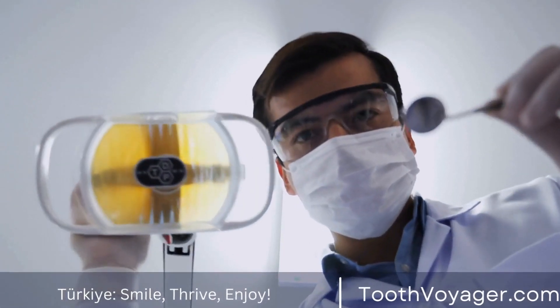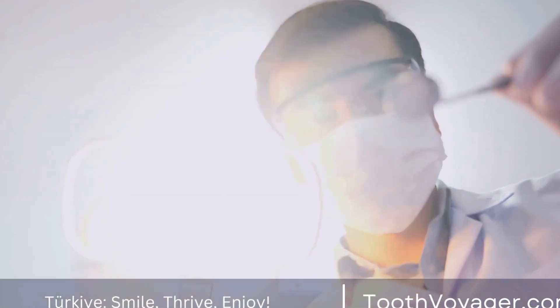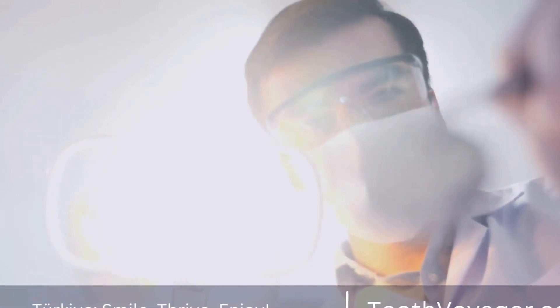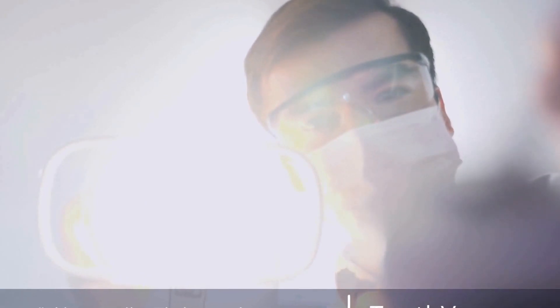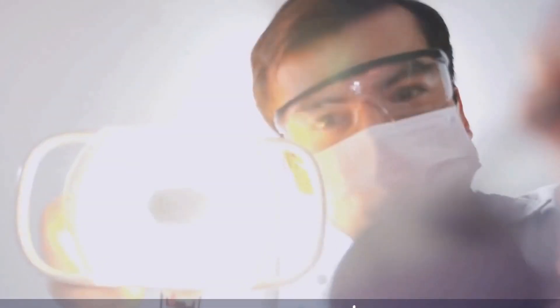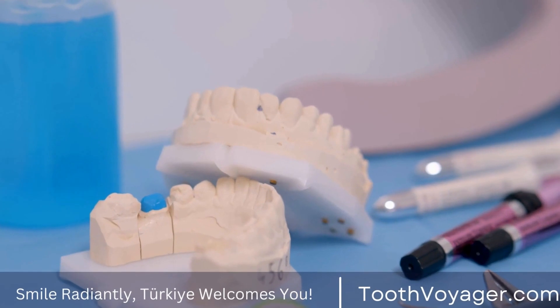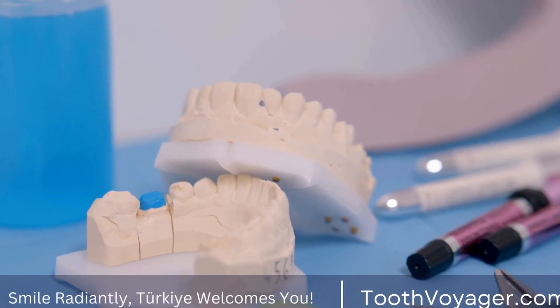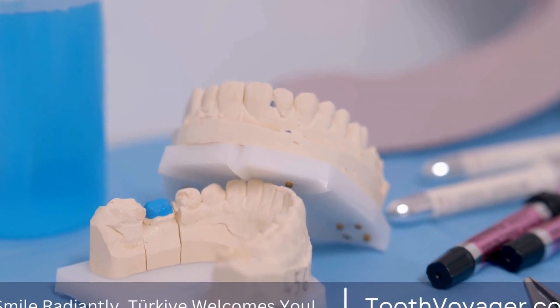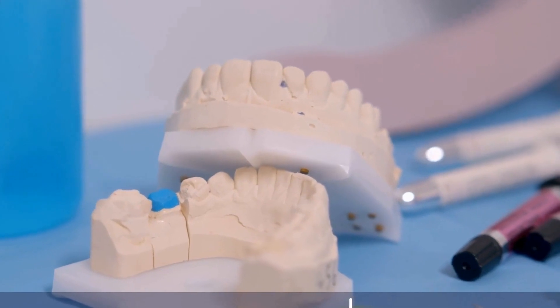Dental x-rays are a vital tool in the field of dentistry, providing valuable information for diagnosing oral health issues and planning appropriate treatments. In this video, we will explore the importance of dental x-rays in dental practice and how they contribute to the overall care of patients.